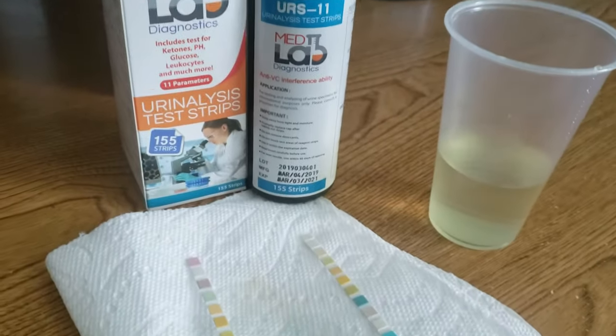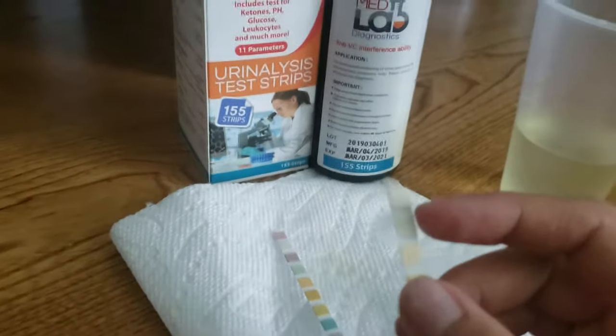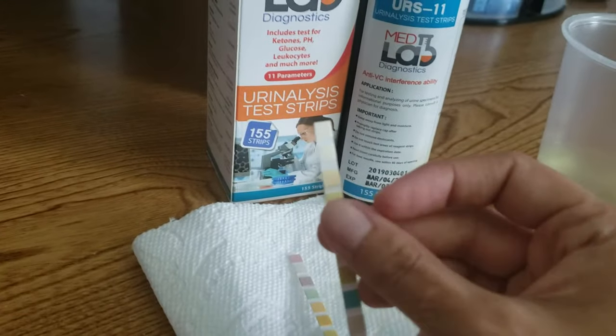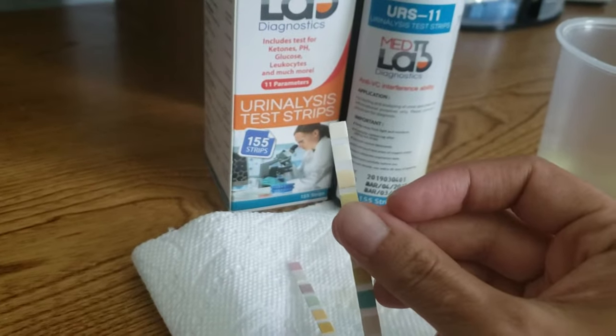So before you test, when you take out a strip, you want to make sure that the leukocyte pad — which is the very top pad on your strip — is still a white, bone-white color. It should look like this, and that lets you know that your strip is still good.